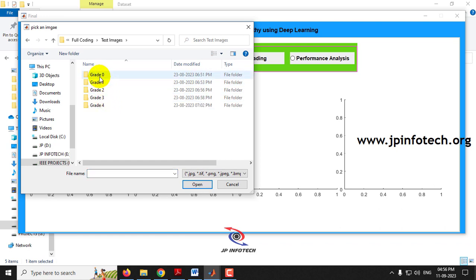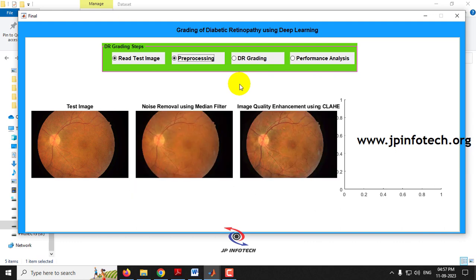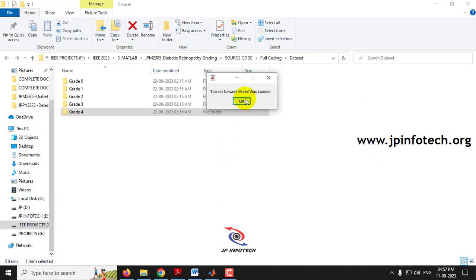Now, going to the test images folder and selecting Grade 0, I choose a random image which is previewed in the GUI. Clicking 'Pre-processing' shows the pre-processed image with noise removal via median filter and contrast enhancement via CLAHE applied. Then clicking 'Diabetic Retinopathy Grading' loads the trained network model, classifies the input image, and the result is Grade 0.